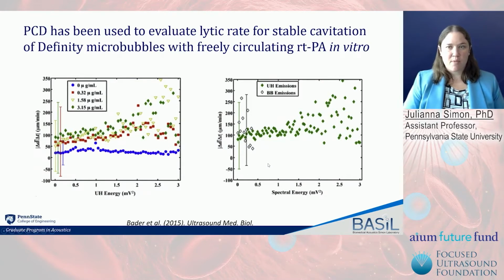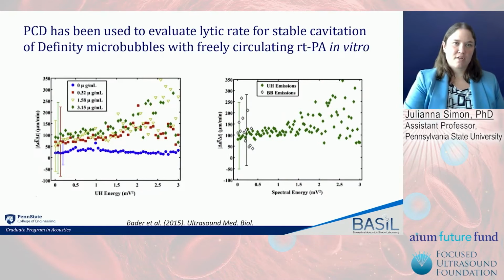He's looking at the ultraharmonics. There's a little bit of broadband emission that, of course, can also help break up the clot. But the stable cavitation plays a big role. And basically, that's all you need to form these tunnels and allow the RTPA in to help dissolve the clot.